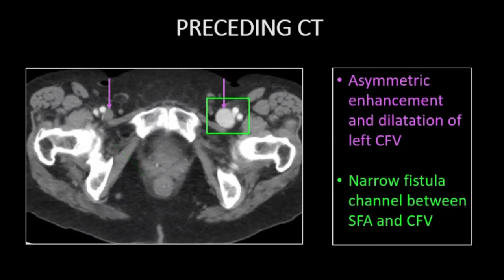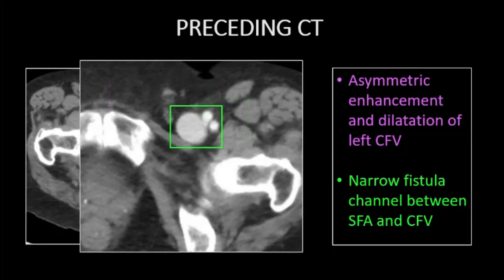The patient underwent CT prior to the ultrasound. The left common femoral vein is dilated and asymmetrically enhancing on this arterial phase study. A very narrow channel connects the artery and vein.